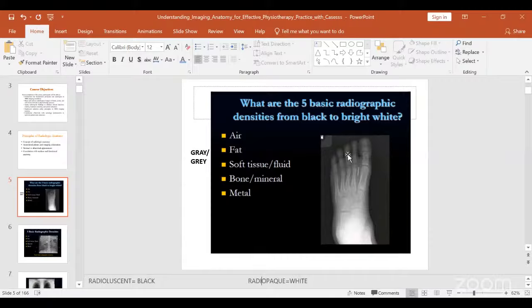Bone, because it is denser, is thicker, and is more difficult to break, absorbs or blocks radiation from passing through, compared to air, compared to lungs that are spongy in nature, which do not substantially absorb or block the X-rays and allow X-rays to pass through.